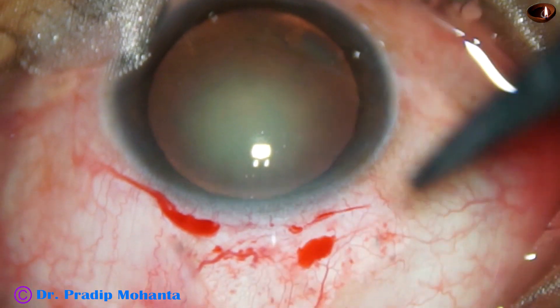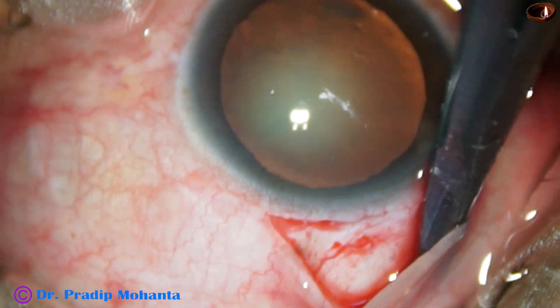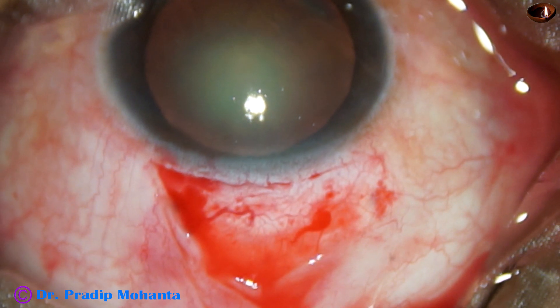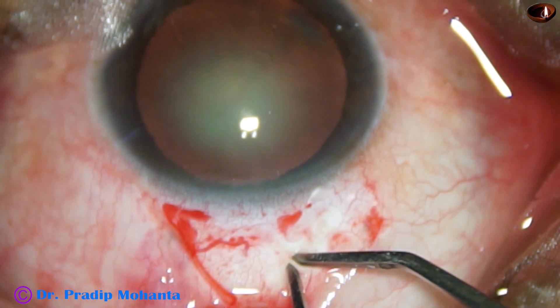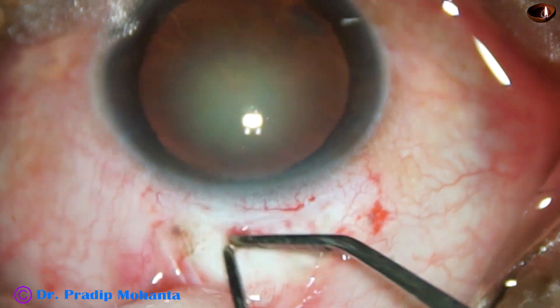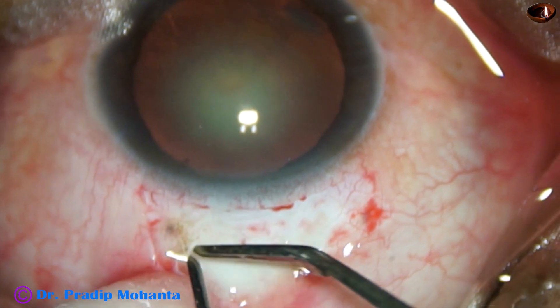Conjunctival peritomy has been done. Now the conjunctiva and tenons is dissected posteriorly so that a large posterior bleb can form. Then mild wet field cautery is done. Care is taken just to touch on the blood vessels and not to cause any contraction of the scleral surface. Very mild cautery just over the blood vessels.